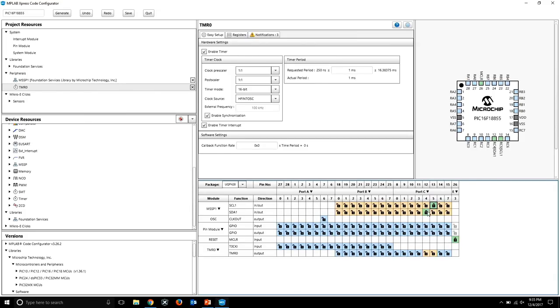Now I'm going to move the SDA to RC3, and move the SCL back to RC4. Now we are reversed. So you temporarily have to shift it a little bit, and then it allows you to select the pin. That's correct. And it just happened to be this case in this particular board, guys.